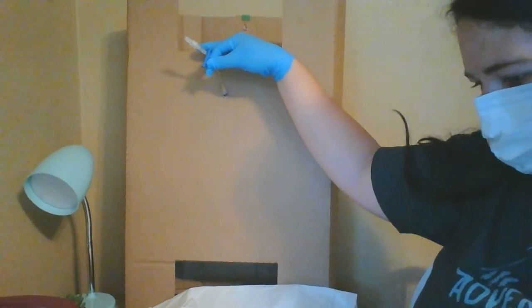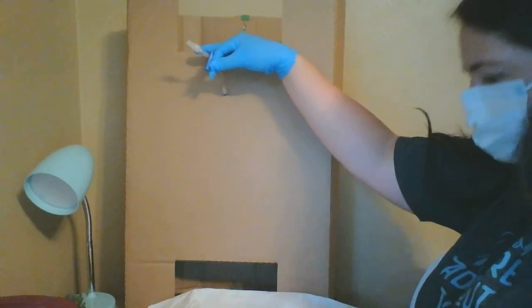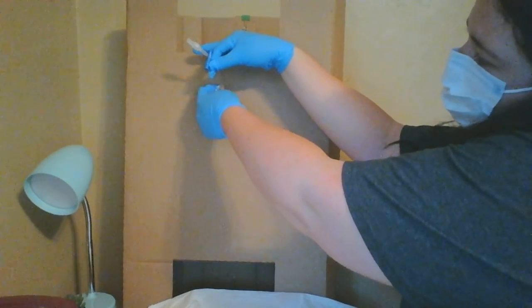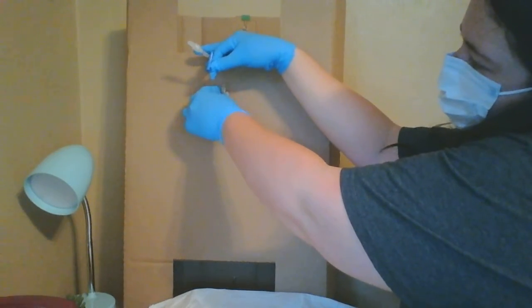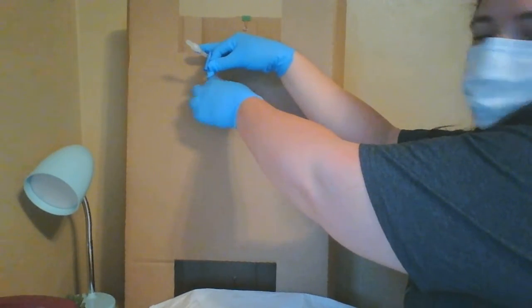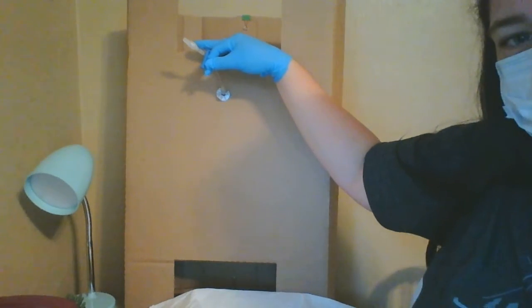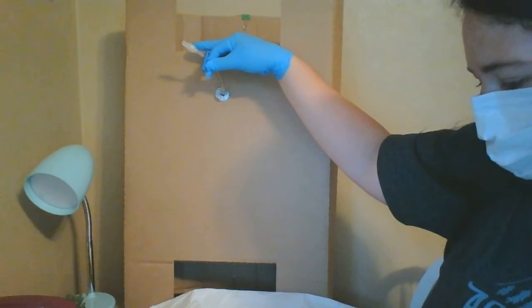So now I'm ready to add my new patch. I'll just grab this and add my new patch. My tubing's a little large for this patch. It's not the right tubing. Right. So I have the new bio patch in place.